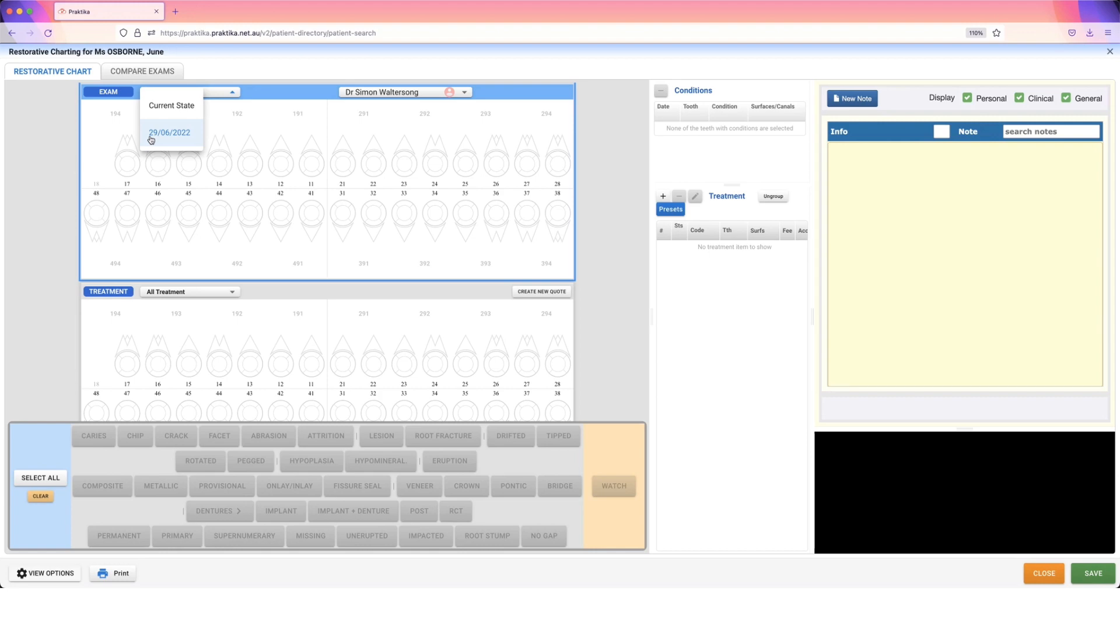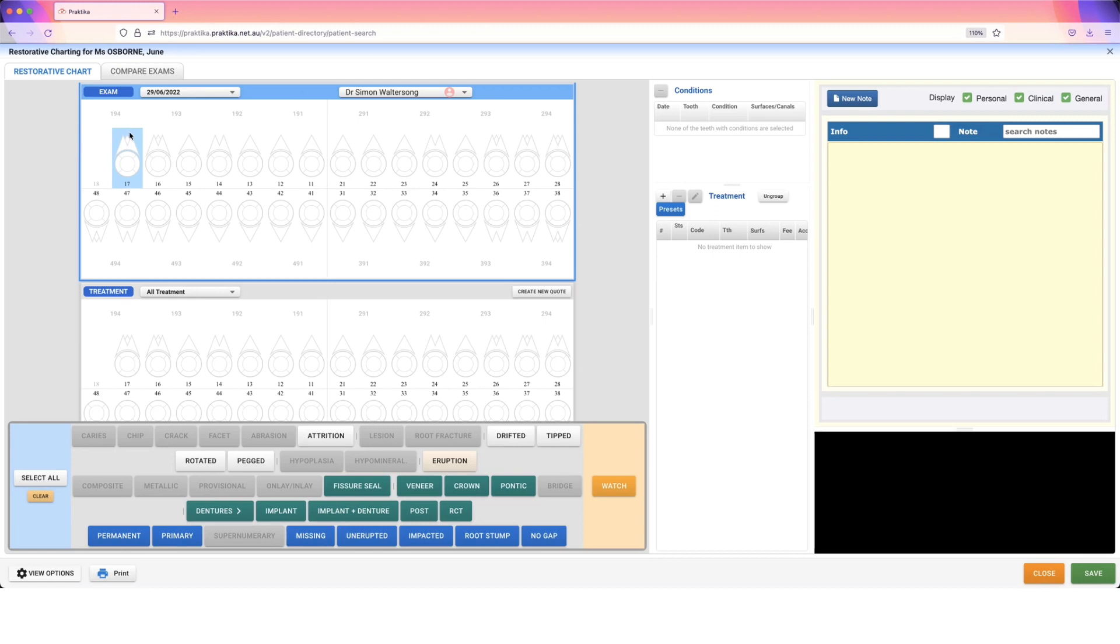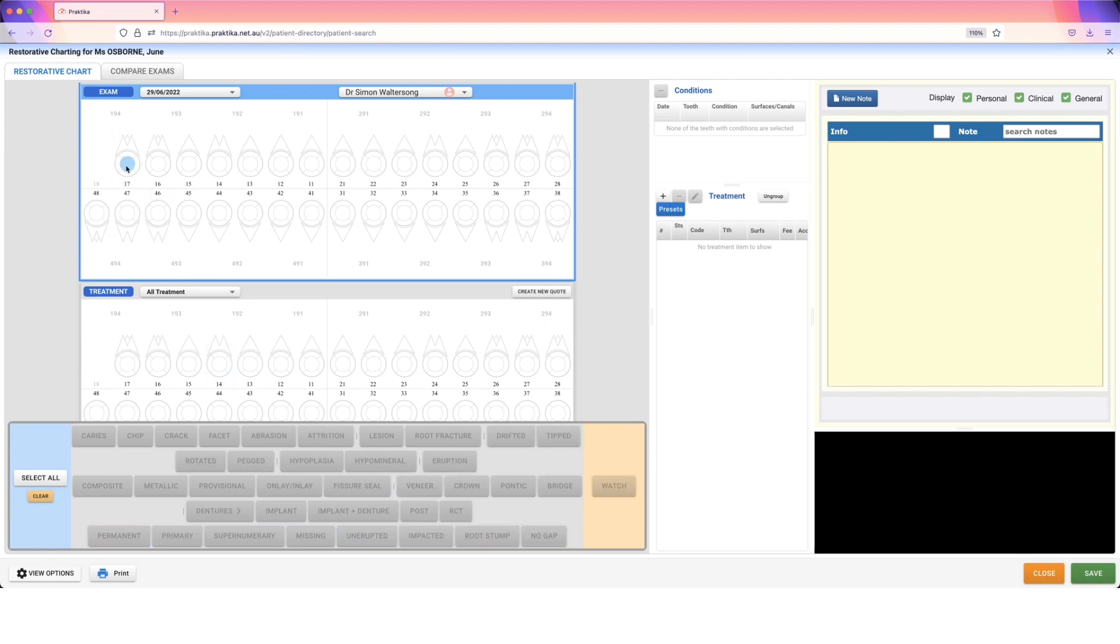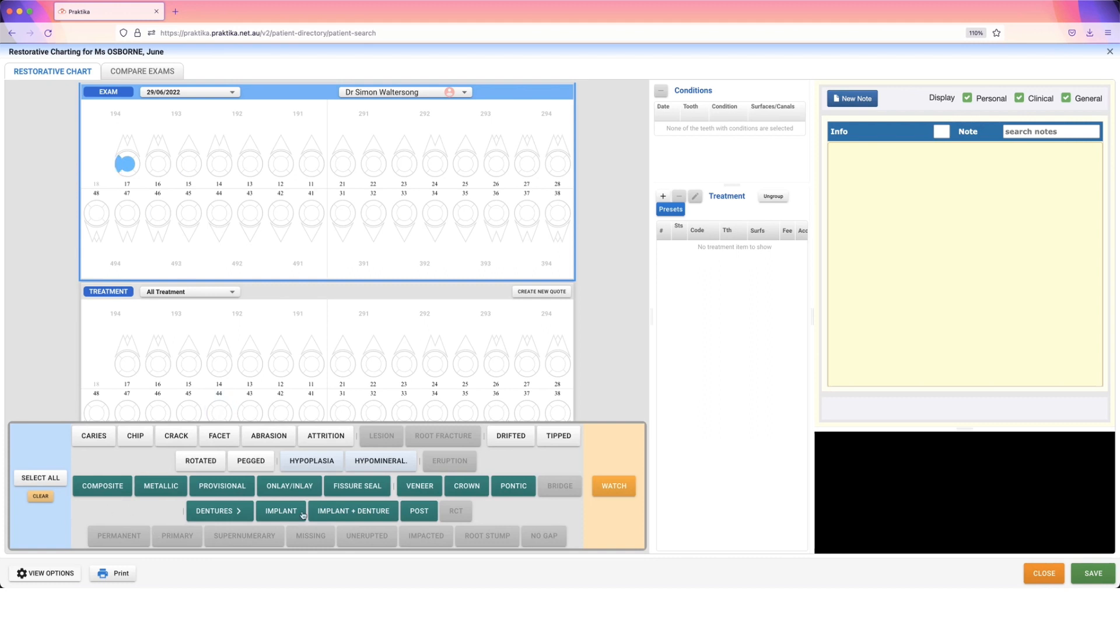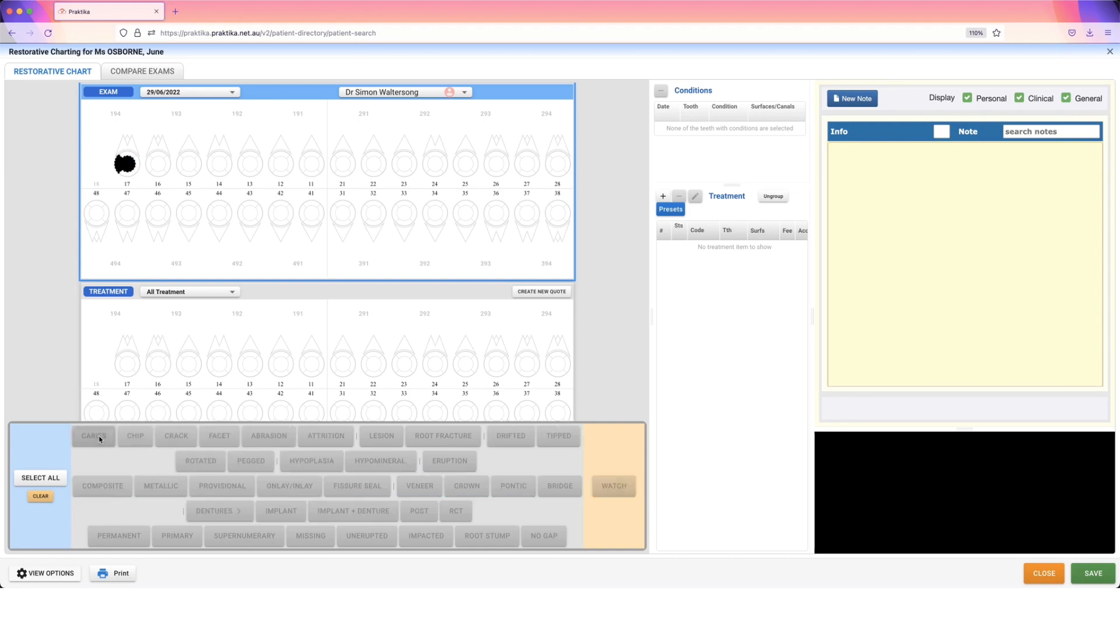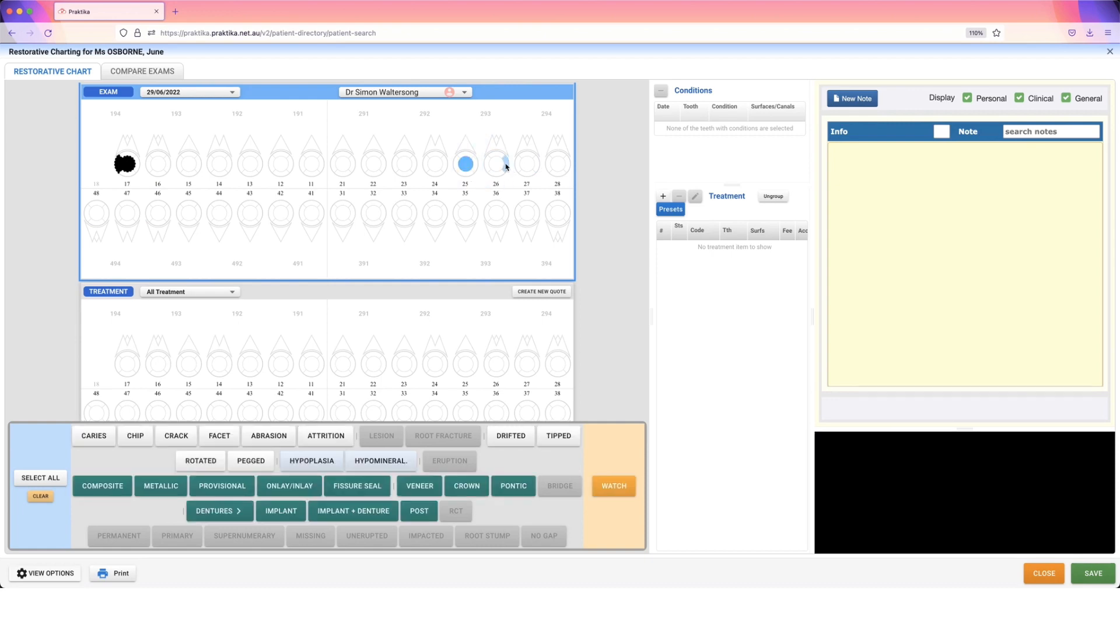Now I can go through and select my tooth, so either select the outside of the tooth here where this is highlighted in blue to make changes to the overall tooth condition, and I've got my options down the bottom here. Or I can select the individual surfaces and it will give me some different options available. So I can say my 1-7 DO has got caries. You can select as many different teeth as you need to, so I can chart all of my caries conditions at the same time. Let's say 2-5, 2-6, they've both got caries. You can keep selecting them and it will remember your previous selections until you actually put something down here.